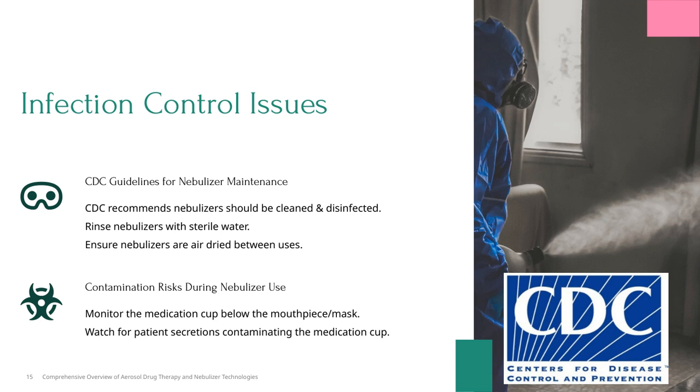The CDC recommends that nebulizers be cleaned and disinfected regularly. After each use, rinse the nebulizer thoroughly with sterile water to remove any residual medication or debris. Additionally, make sure that the nebulizer is allowed to air dry completely between uses, as moisture can promote bacterial growth.